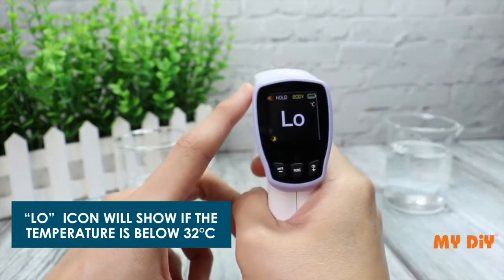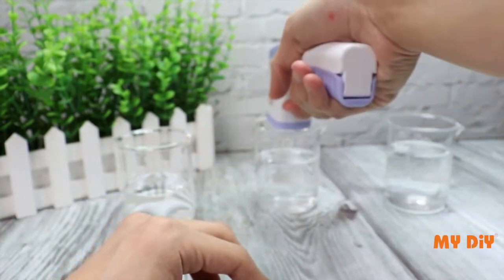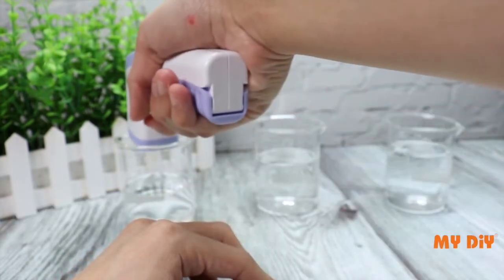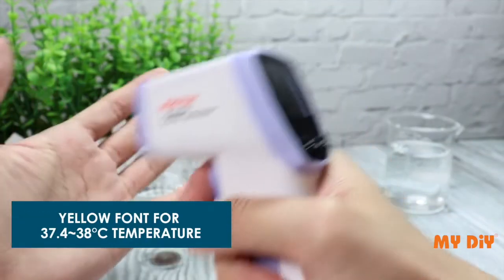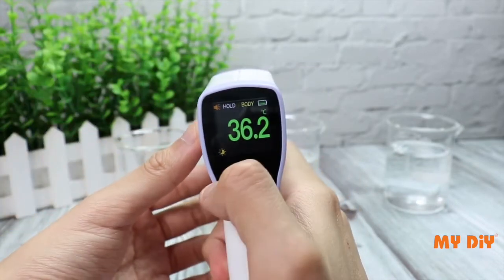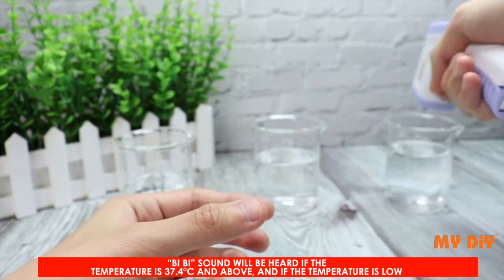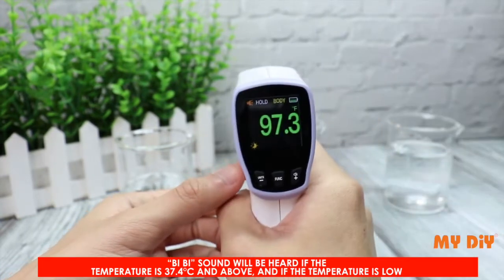A low icon will show if the temperature is below 32 degrees Celsius. Green font indicates normal temperature, orange font and yellow font are also available indicators. A BB sound will be heard if the temperature is 37.4 degrees Celsius and above, and also if the temperature is low.